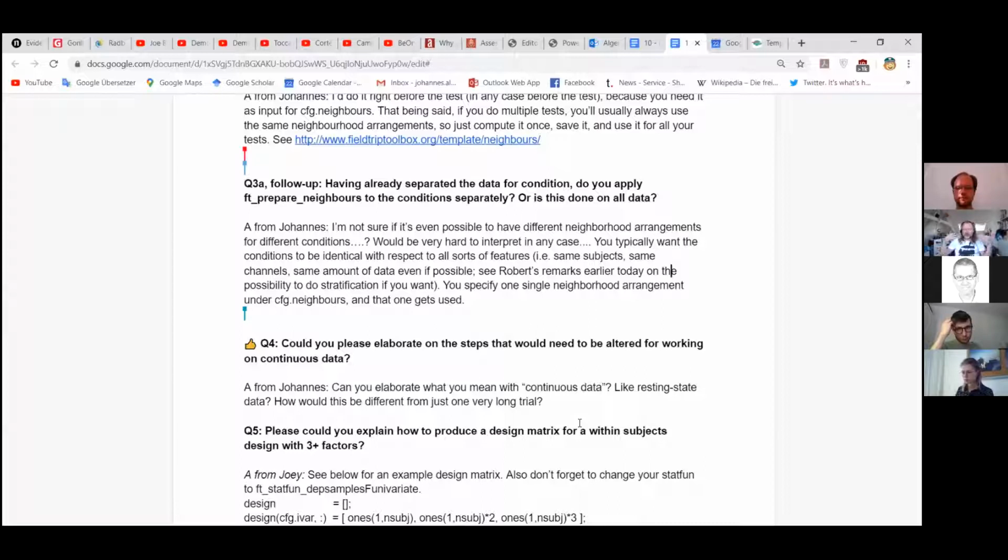Well, in this case, it's language experiments or auditory experiments, so it's about temporal channels, but that's something that you would have to consider, especially with EEG. You would more often have channels at random locations missing in different subjects. So what I would do, if I want to do channel level statistics, is interpolate those channels so that you have an even coverage of all the channels in all your participants, rather than leaving them out.